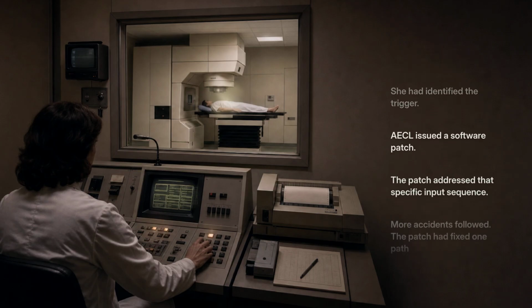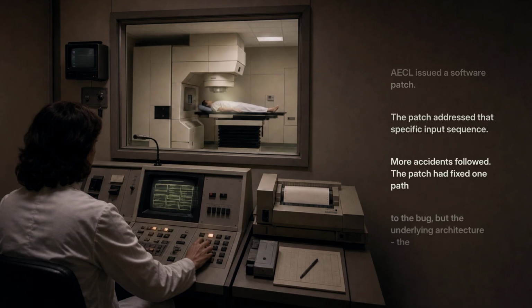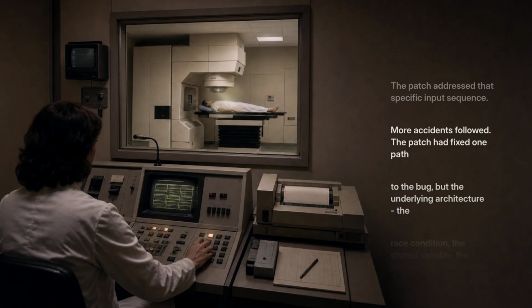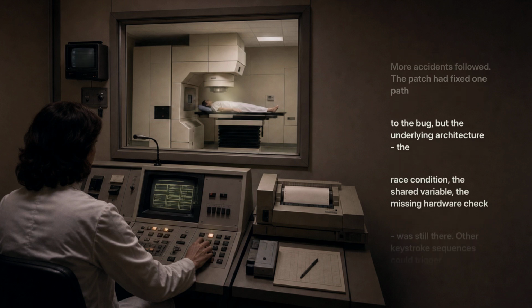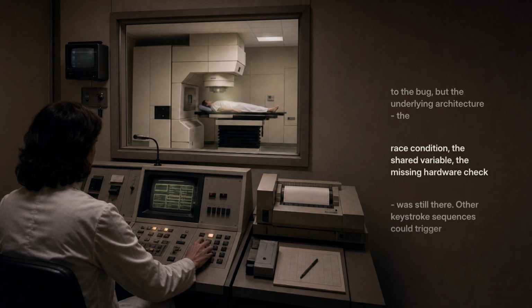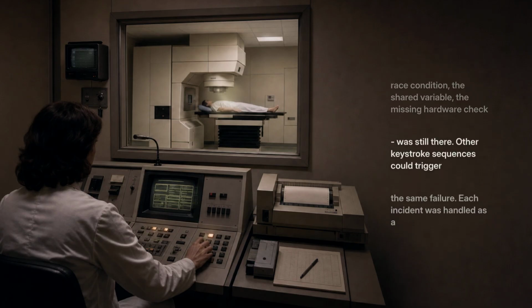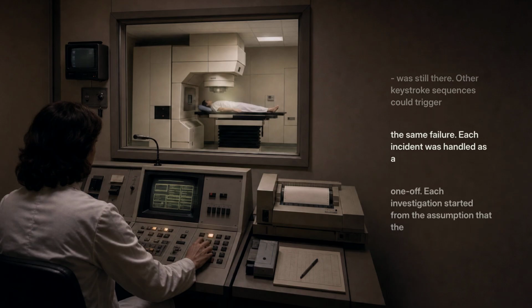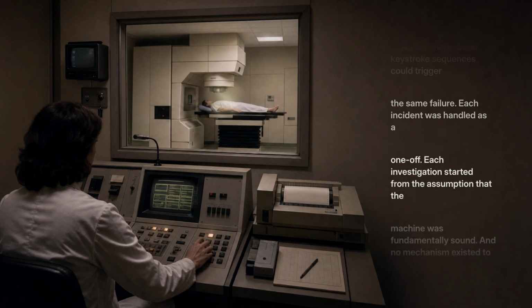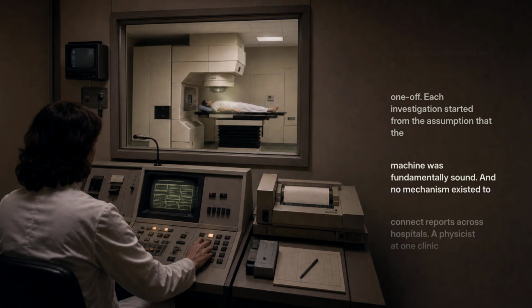The operator reported the exact keystroke sequence. She had identified the trigger. AECL issued a software patch. The patch addressed that specific input sequence. More accidents followed. The patch had fixed one path to the bug, but the underlying architecture, the race condition, the shared variable, the missing hardware check, was still there. Other keystroke sequences could trigger the same failure.